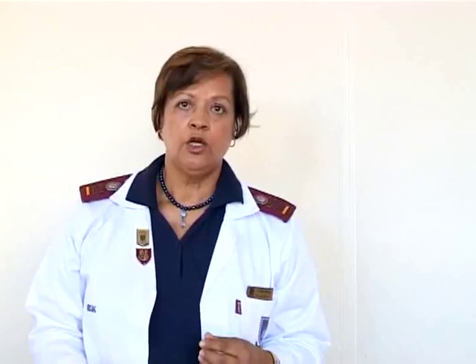When doing the examination of the ears, we must always examine the unaffected ear first and then the affected ear, so that there is no cross infection, and also so that you can see what the normal ear looks like and then identify the abnormal in the affected ear. You must also choose the correct speculum or earpiece to do the examination with.